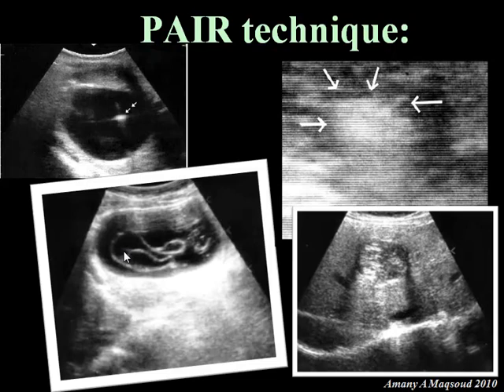And then you have this picture. This is the same patient. This is the technique in the same patient. This is a simple cyst, and when you aspirate, the germinative layer that we talked about before, due to the decrease in the intracystic pressure, separates from the wall of the cyst and lies inside like that. This is the rosette appearance that we talked about a little bit before. And then you inject the scolicidal agent. The cyst becomes hyperechoic, and you leave the scolicidal agent inside for 10 to 20 minutes, and then you re-aspirate it again.